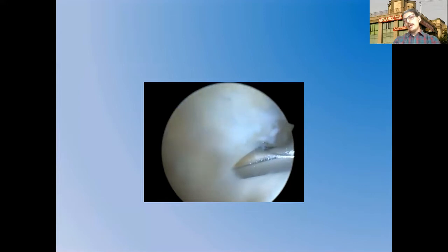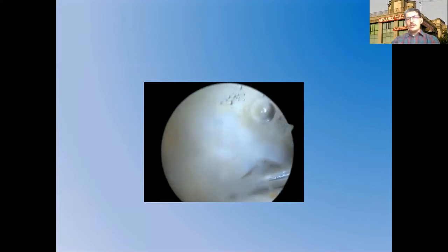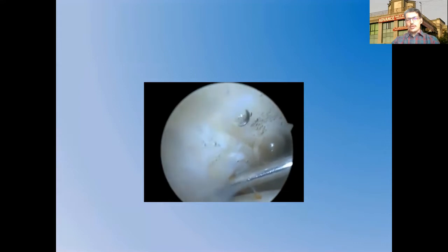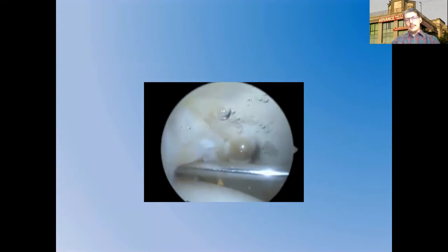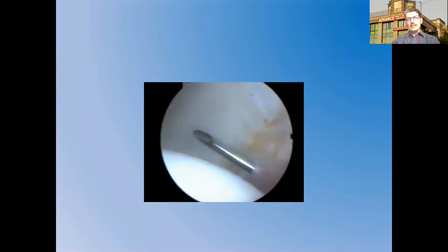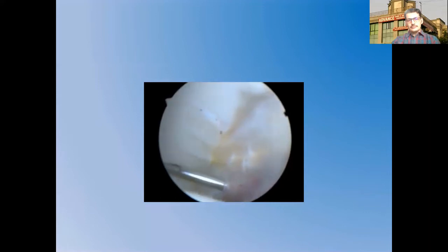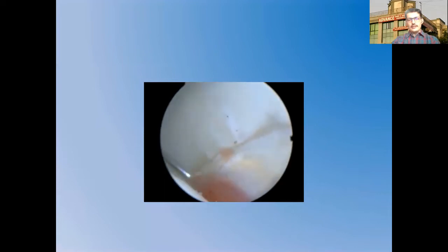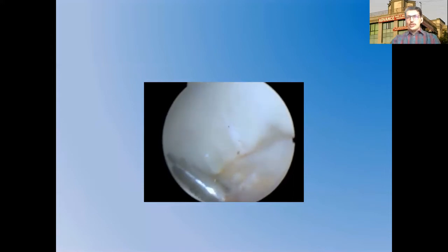A guidewire is inserted through the needle, the needle is removed, and cannulated instruments are inserted one by one. A cannulated trocar is inserted just below the labrum. The pulvinar and hip joint are visualized, and a half pipe is inserted through the cannulated instrument to increase maneuverability. The labrum is visible and does not appear normal.